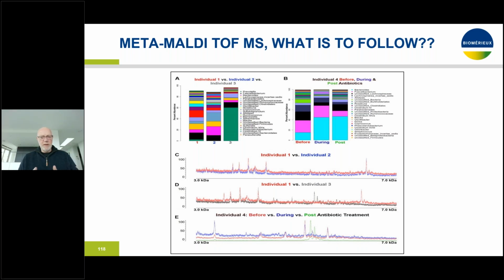If people are treated with antimicrobials, their gastrointestinal flora, for instance, becomes heavily perturbed. That's why some antibiotics also cause diarrhea. So there is a simplification of the flora. And in order to cure completely, it would be good if the flora re-establishes itself in its complexity. And this is something that you could potentially easily measure with this type of mass spectrometry technology.